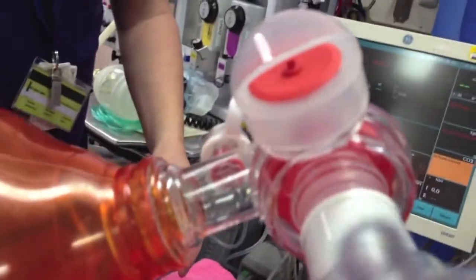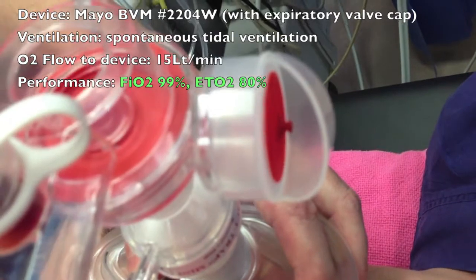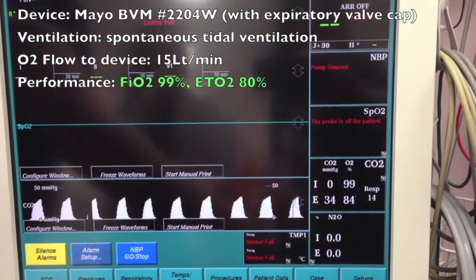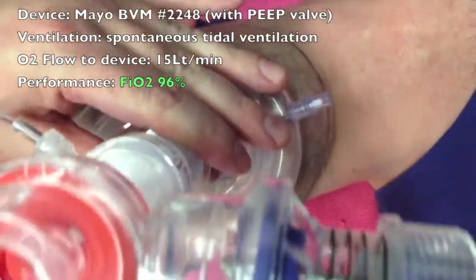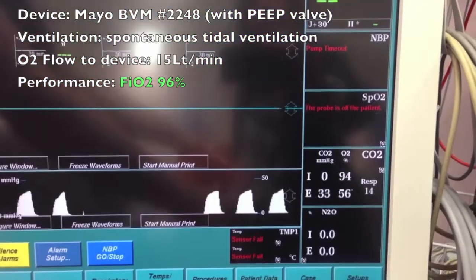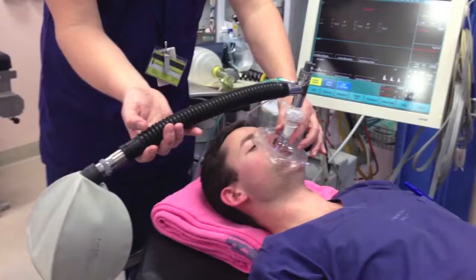Addition of a valve to the expiratory port of the Mayo bag valve mask prevents entrainment of room air when a negative pressure is generated and restores its ability to deliver inspired oxygen concentrations in excess of 95% with spontaneous ventilation. Addition of a PEEP valve to the expiratory port has an identical effect, again allowing the device to deliver high oxygen concentrations to spontaneously breathing subjects.